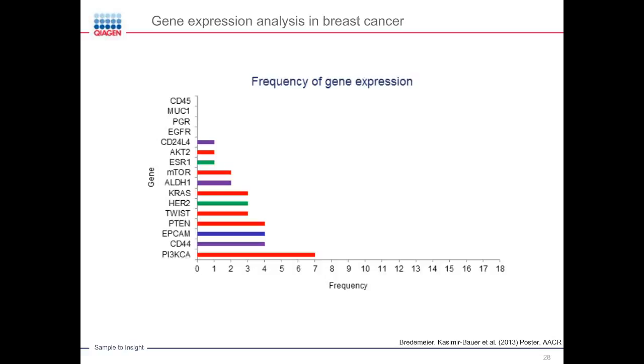And we clearly could see that using the AdnaTest enrichment process and the cDNA we developed with these kits was enough material to really address up to, let me say, 20 genes or so, because this is the random number that we usually use if we now develop ADNA panels.